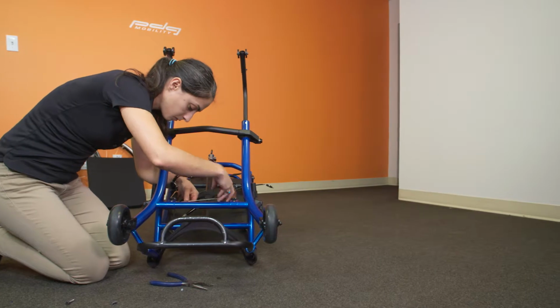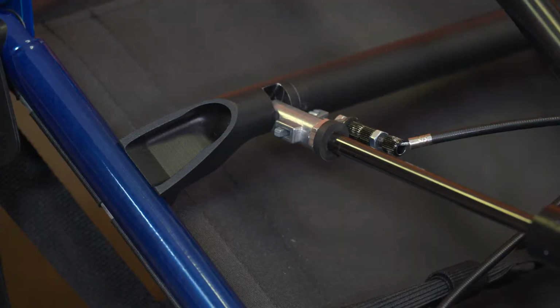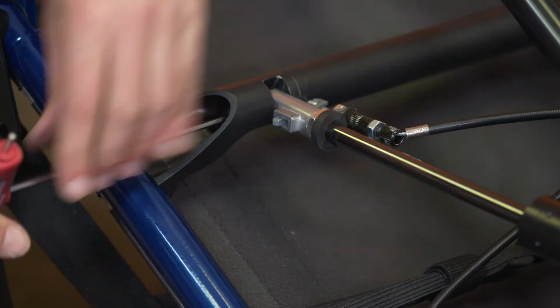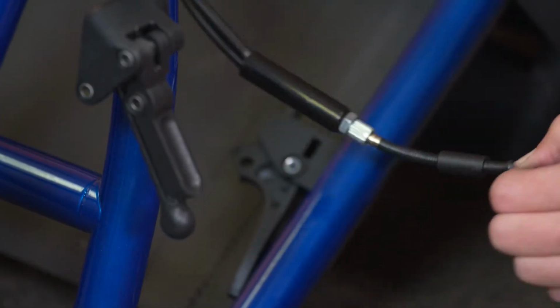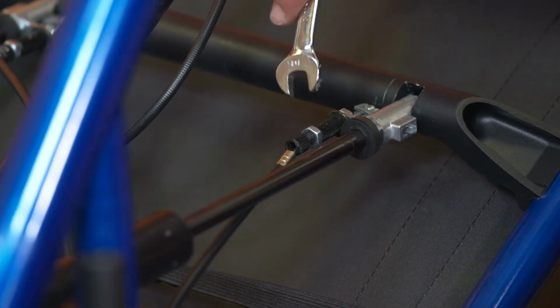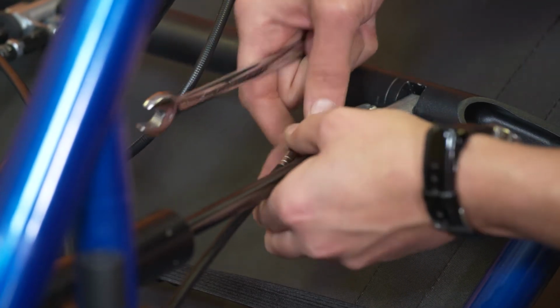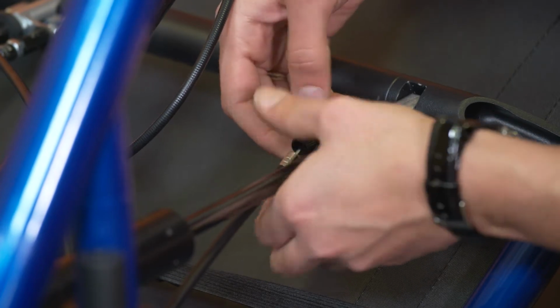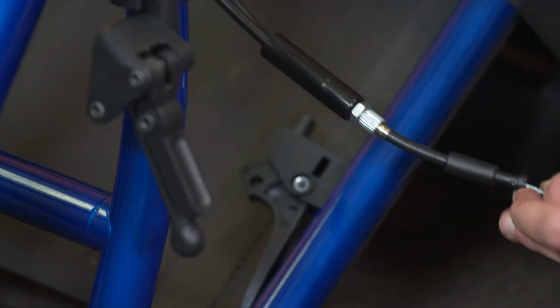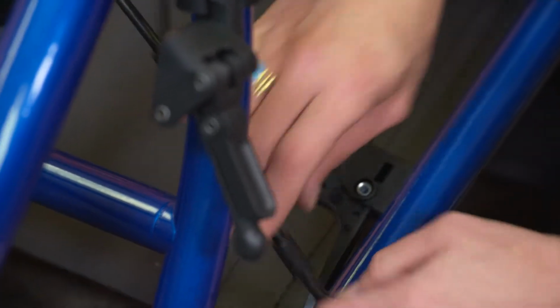And reinstall the fasteners starting at the bottom attachment point, followed by the fastener at the rear upper frame crossbar. Now you will need to reattach the cable to the activating trigger on the upper frame. In order to do this, you need to first loosen all the cable sheath to allow the cable to move freely. Now that the cable can move freely, it can easily be reattached to the activation trigger on the upper frame.